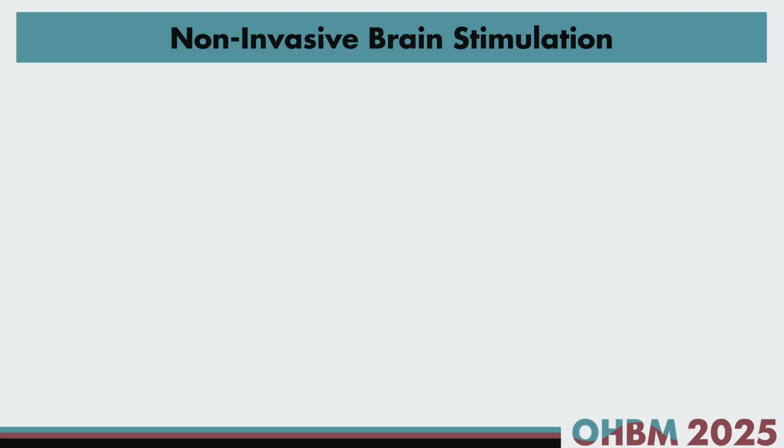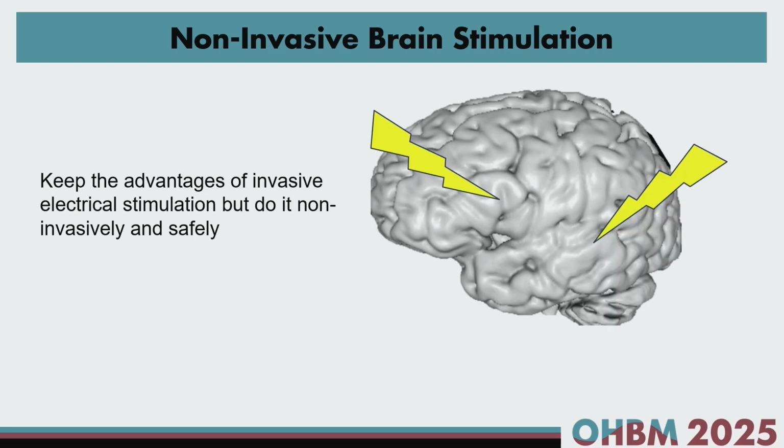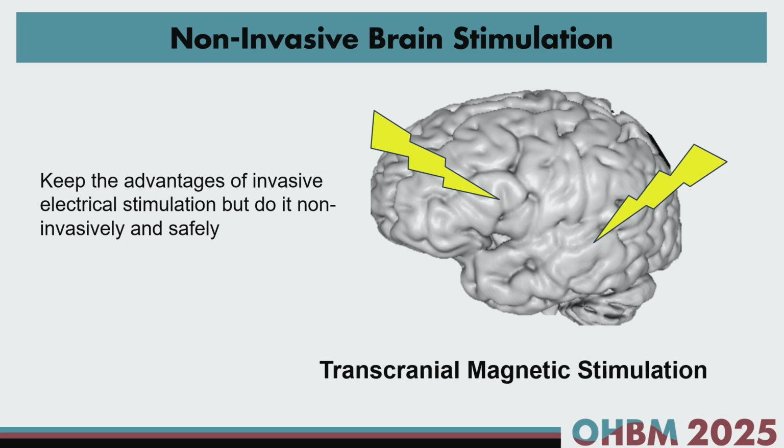So when we talk about what could be an alternative if these other modalities are not feasible, we really want to think about something which is similar to the gold standard. So the gold standard still is direct cortical stimulation mapping. So what is something that is much closer to that but can be done non-invasively? That would be where we bring in TMS, transcranial magnetic stimulation, as a way to look at brain function and really understand either language or motor networks in these patient populations where perhaps other modalities are not useful.